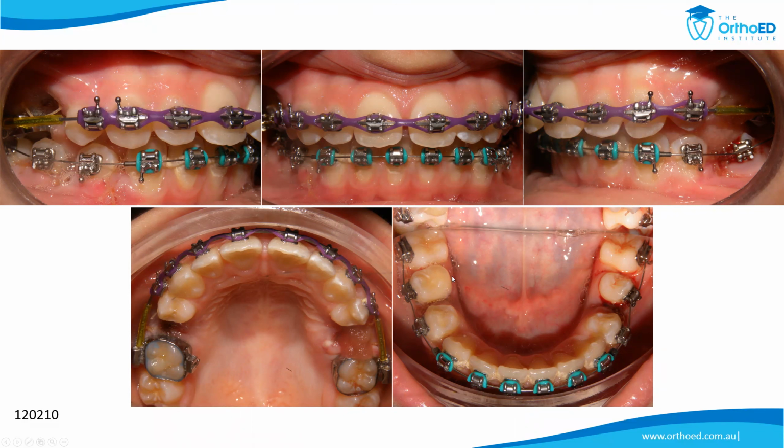Okay. On the upper, Jeff, is that a wound dressing or something that she's got there on the left side? Yeah, that'll probably be, I would imagine, just an Alba-Gel pack or whatever it be. I've got no idea, but that's just a wound dressing. Okay. Yep. So here now, we've lost a bracket at the time of the surgery on that upper right 4.